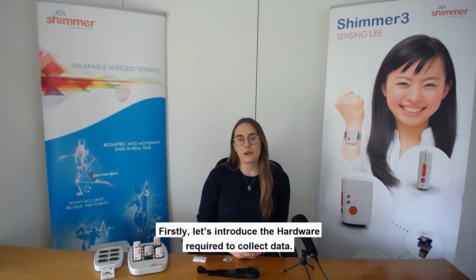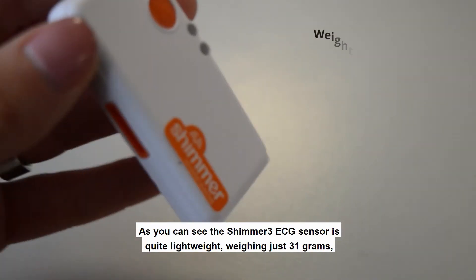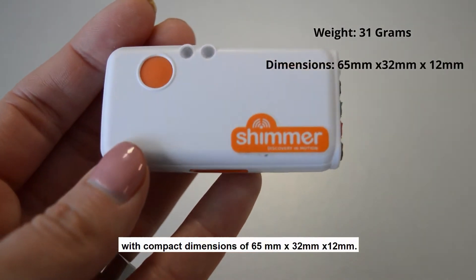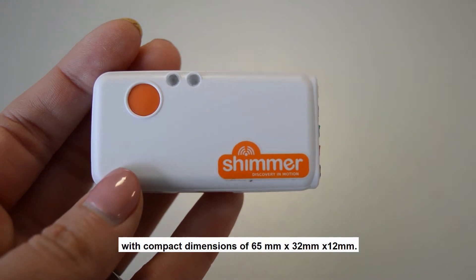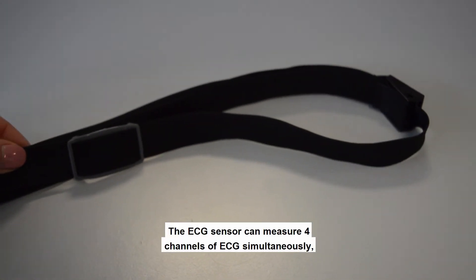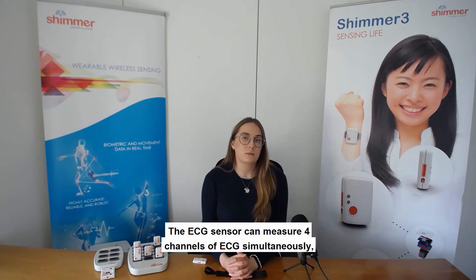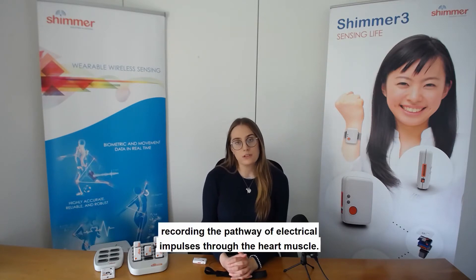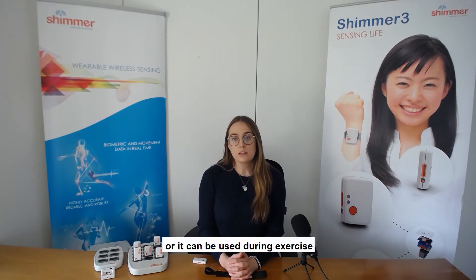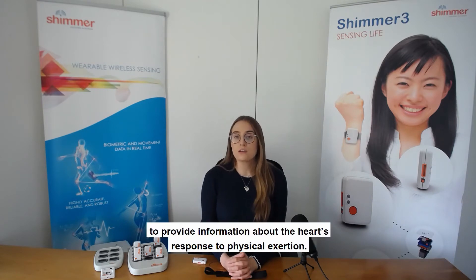Let's introduce the hardware required to collect data, beginning with the sensor. The Shimmer 3 ECG sensor is quite lightweight, weighing just 31 grams with compact dimensions of 65 by 32 by 12 millimeters. Each of the Shimmer ECG sensors comes with a waist strap for placement on the body. The ECG sensor can measure four channels of ECG simultaneously, recording the pathway of electrical impulses through the heart muscle. It can be used on resting or ambulatory subjects, or during exercise to provide information about the heart's response to physical exertion. The Shimmer 3 ECG unit provides a five-wire, four-lead ECG solution.